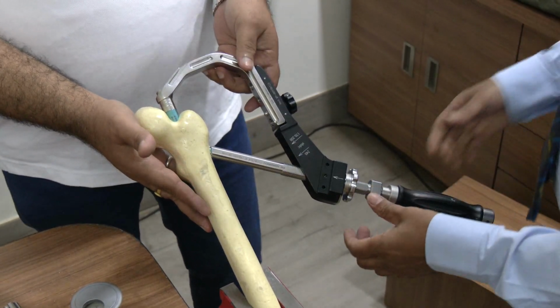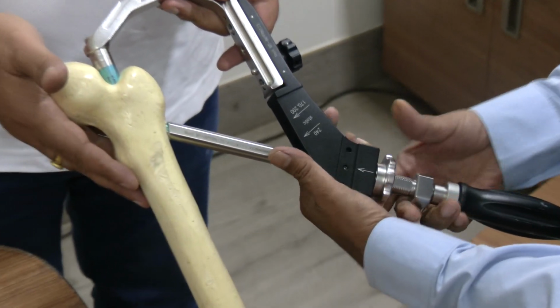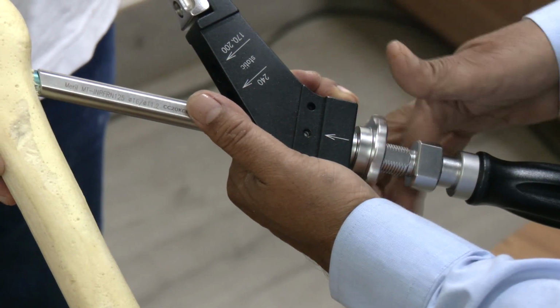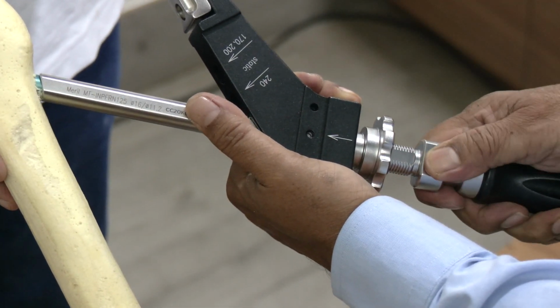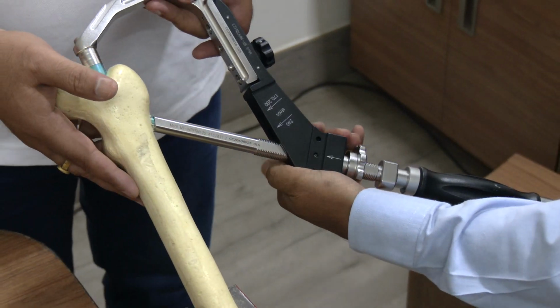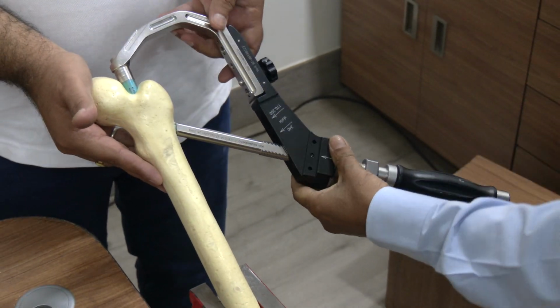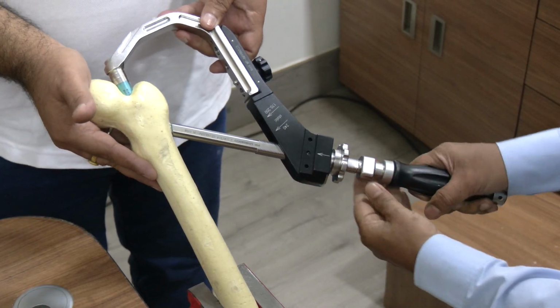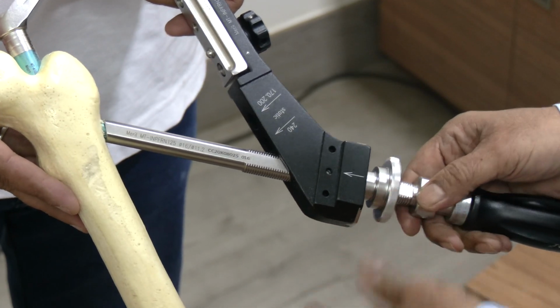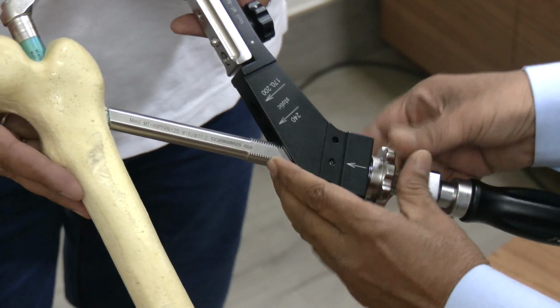Now for you all to see, I will unlock and show, but normally we don't do that. I unlock and take this slightly out so that you can see how much it has come out. You can see that it has been hammered quite well inside. Still I can hammer a little more. Okay. Now I will tighten the screwdriver. I'll take out the sleeve for you to see properly.